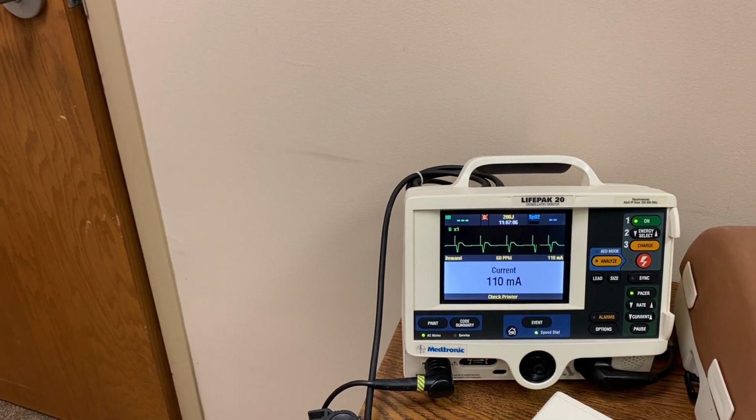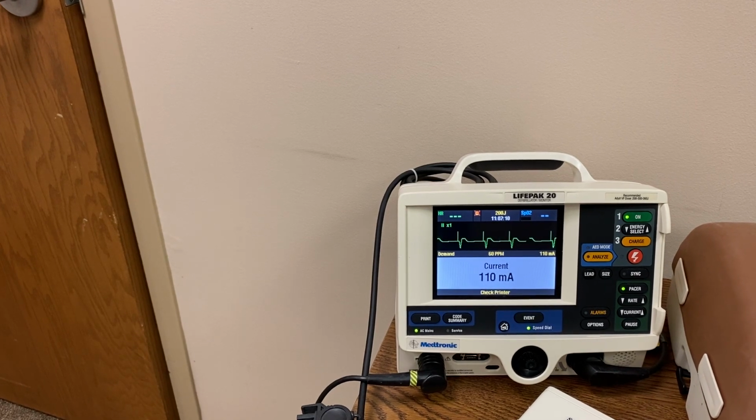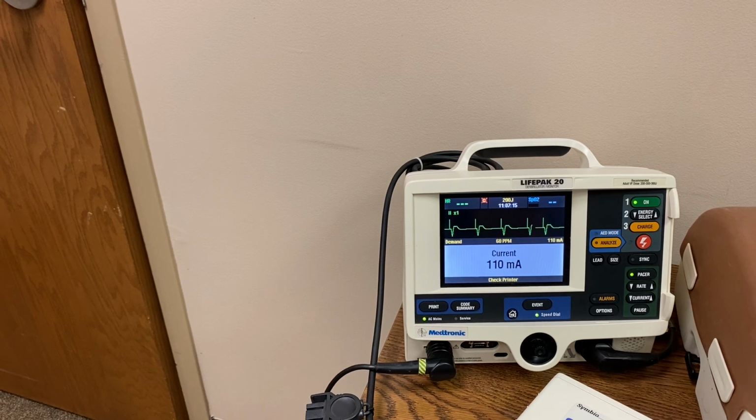You also want to make sure that you check a mechanical pulse. You want to make sure you check your patient's pulse. Do they have a pulse? If they don't, what do we need to do? We need to start CPR right away.